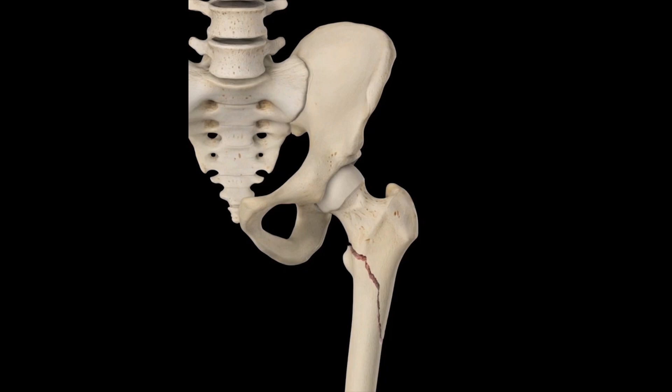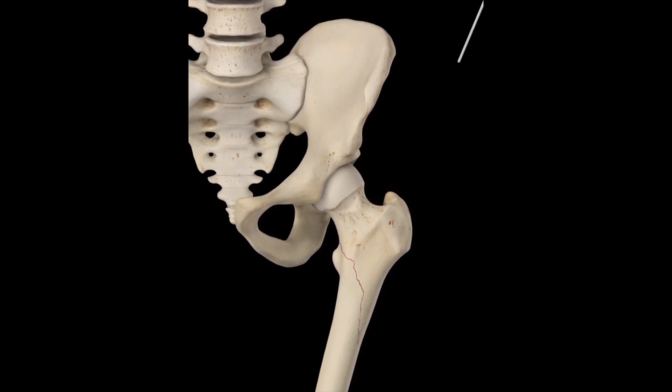The proximal femur has suffered a multifragmentary fracture that travels inferior medially along the intertrochanter line, exits below the lesser trochanter, and breaks the conical eminence away from the bone.